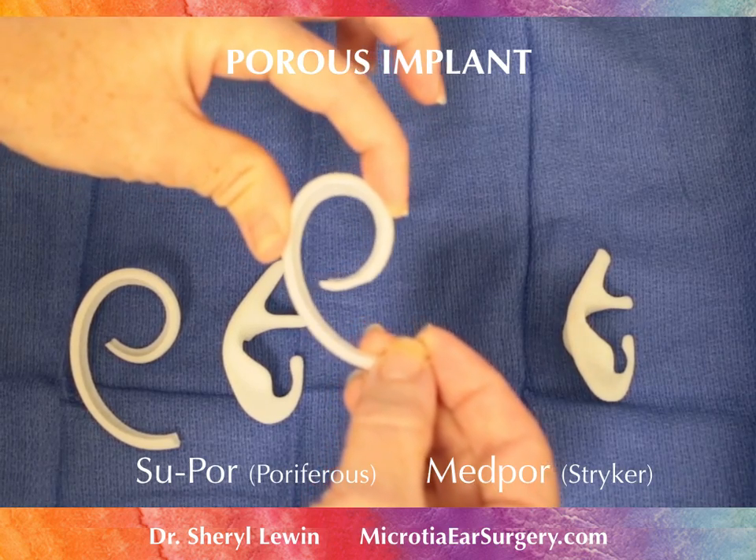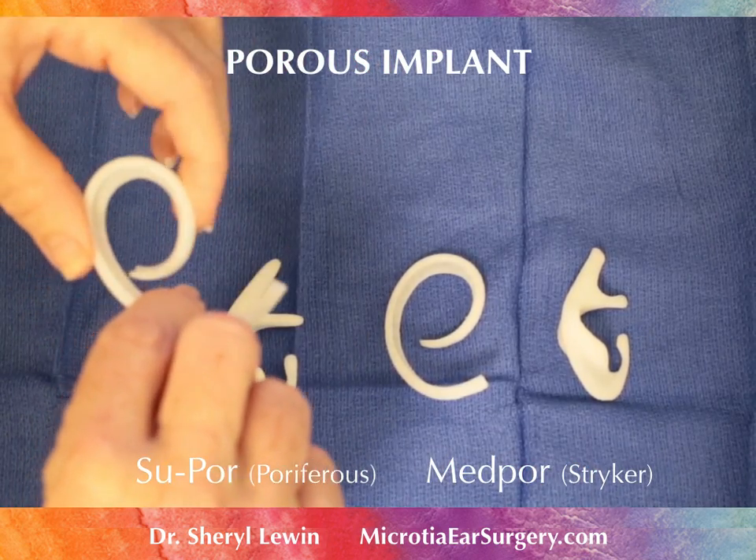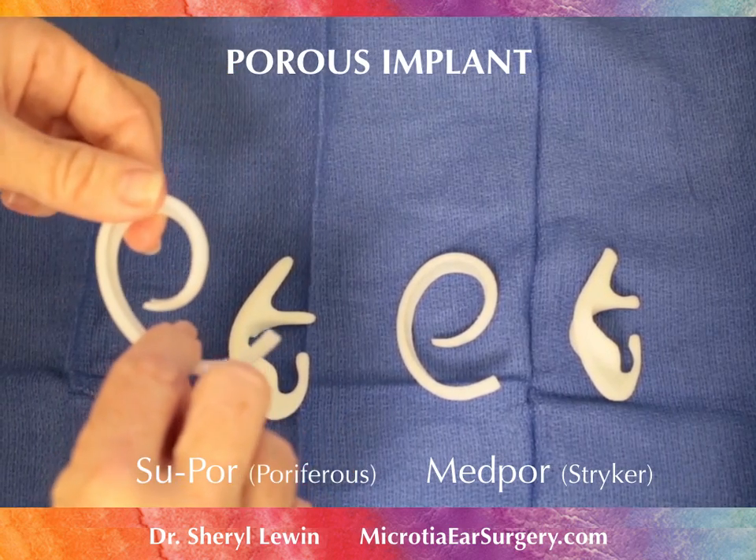And its ability to squish this way — there's significant resistance with the MEDPOR — whereas the SUPOR, you can completely twist it and it just bounces right back.